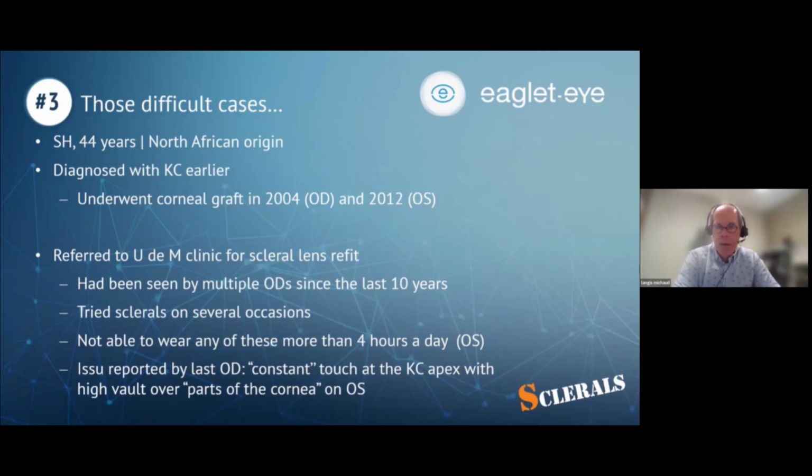And it's okay when you have no other resources, but we are fortunate to have access to scleral and specialty lenses that are widely available in North America, Europe, and many other countries. So we have to deal with these patients who underwent corneal graft. She had a first eye done in 2004, a second eye in 2012, and immigrated here in recent years, and obviously in some offices, they don't deal with specialty cases, so they refer the patient to us. We are more than happy to welcome them.